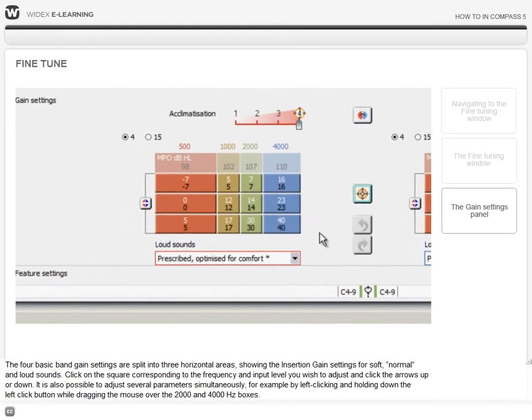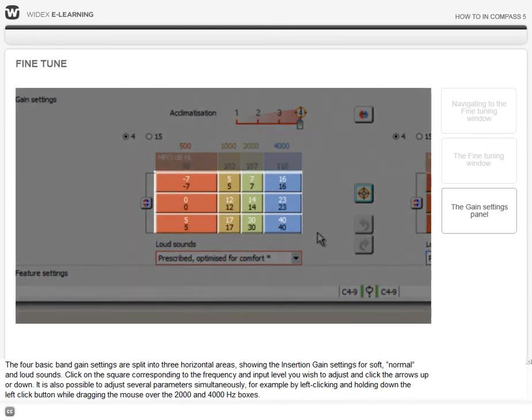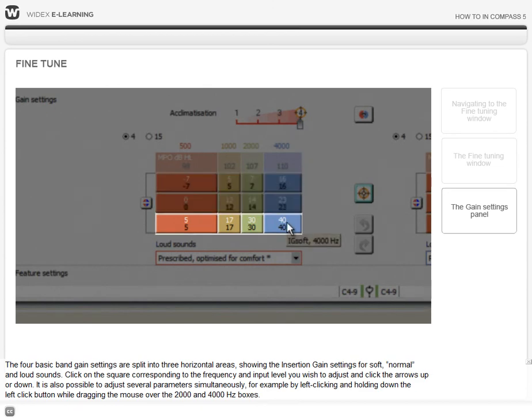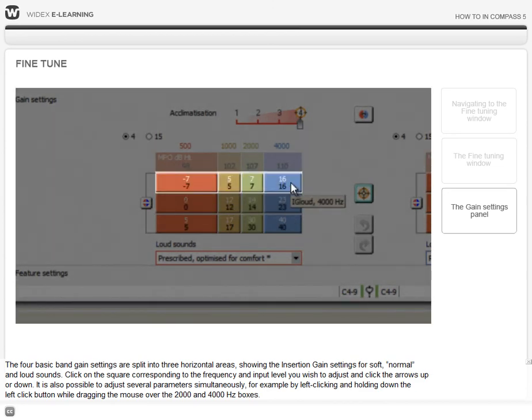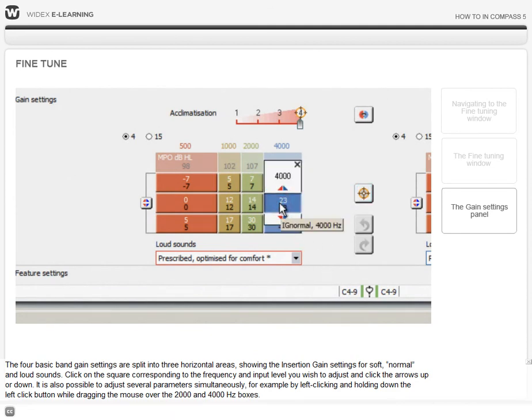The four basic band gain settings are split into three horizontal areas, showing the insertion gain settings for soft, normal and loud sounds. Click on the square corresponding to the frequency and input level you wish to adjust, and click the arrows up or down.